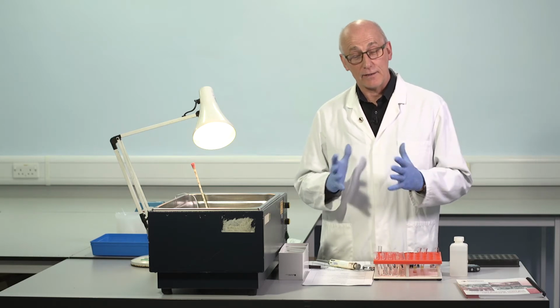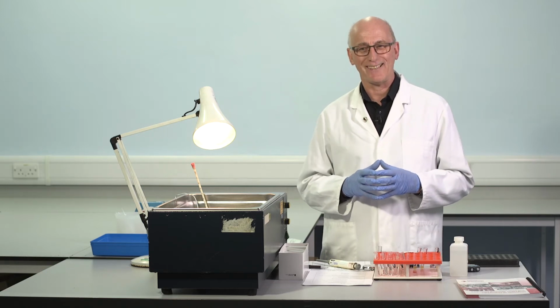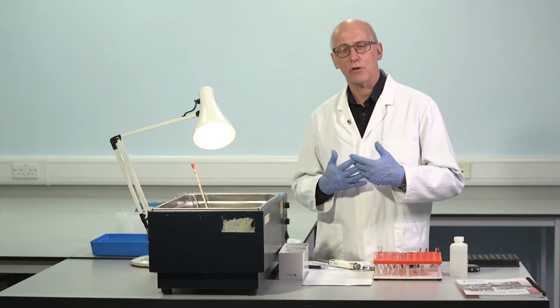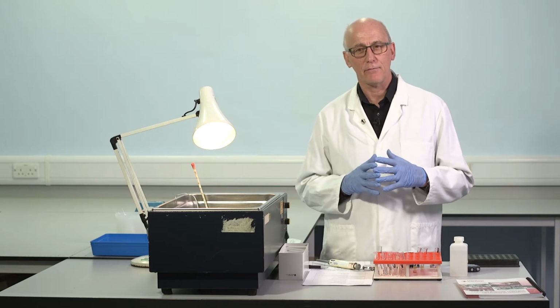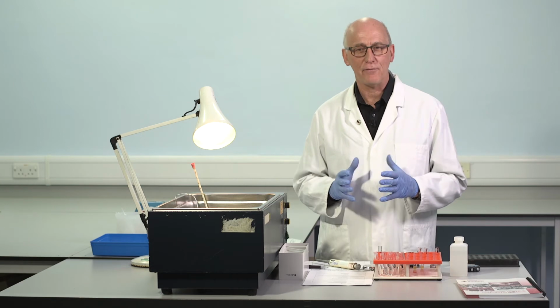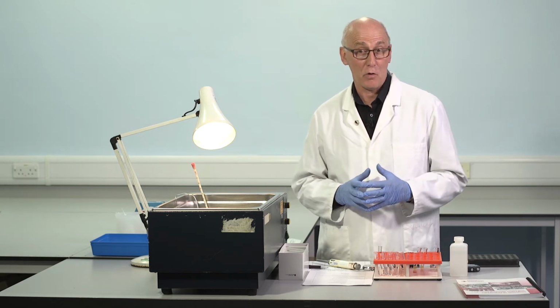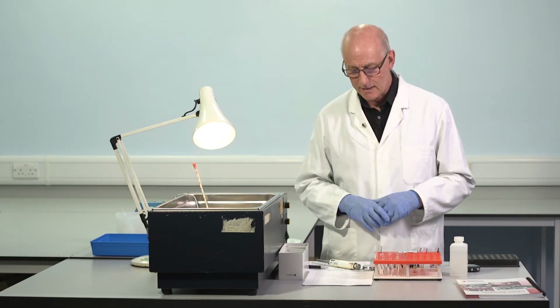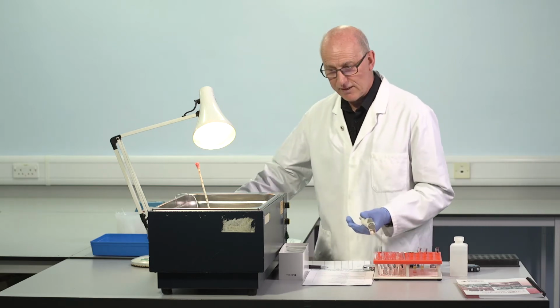And the second, which again we'll look at when we come to the calculations, the second important criteria for a valid assay, the dose response line for QCs and for patients. These should be parallel to the dose response line for the calibration or standard. Without that parallelism, we have no evidence that the 2 materials are behaving in the same way. Actually, we know if they're not parallel, they're behaving in different ways, and we lose that criteria of a valid assay. So these samples are now to temperature.